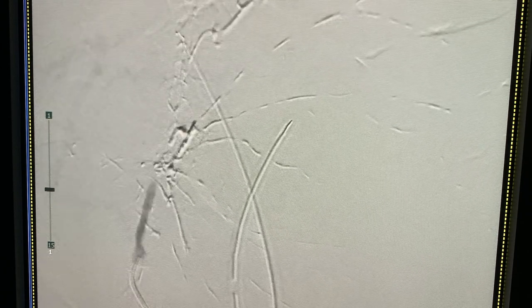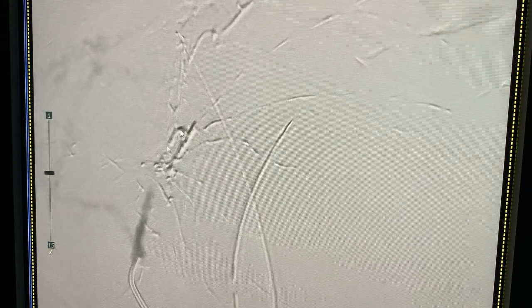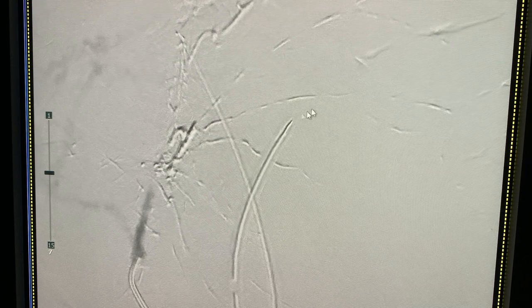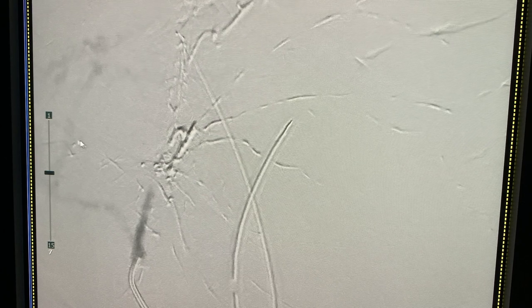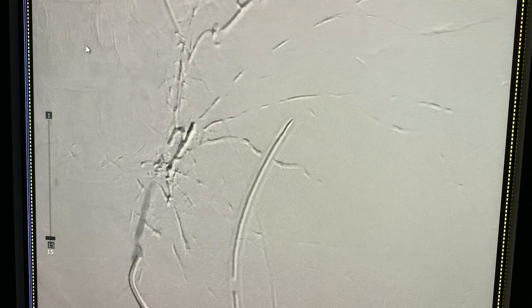This is the post-embolization run through our base catheter, which is parked in the proximal left gastric artery. You can see our glue cast spreading out into the distal branches of the left gastric. We have complete stasis — the area of extravasation seen on the prior runs is no longer visualized, and the more distal branches are all in complete stasis.